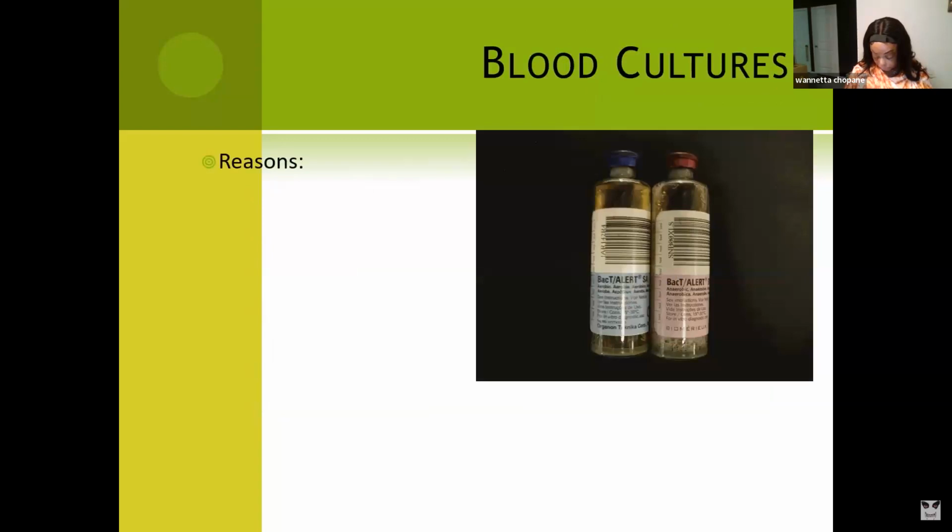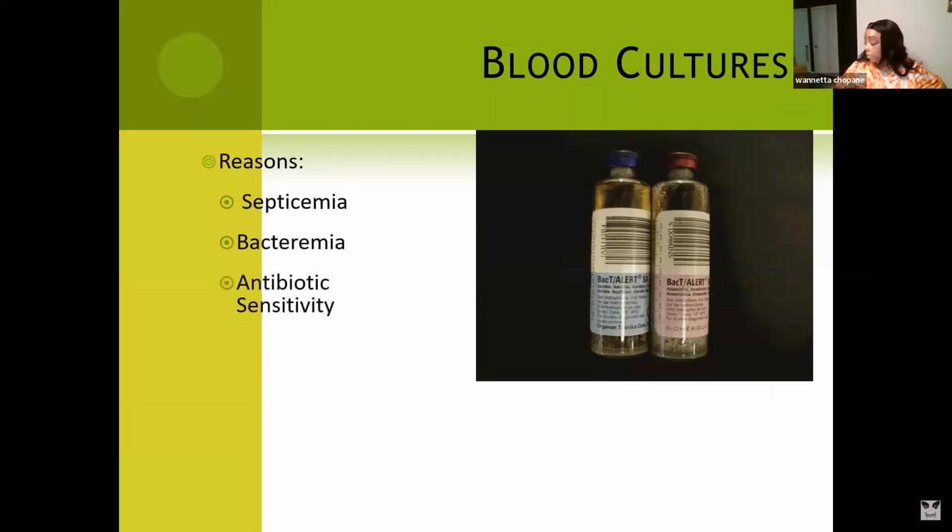Now let's talk about blood cultures and why a doctor will order blood cultures. One reason is to check for septicemia. If a patient comes in with the symptoms of fever, chills, or tachycardia, the doctor will order blood cultures to determine if there is a bacterial infection that's circulating through the blood throughout the body. Now, if there's no symptoms, but the doctor suspects that there might be a bacterial infection, the doctor will check for bacteremia. And again, we might also check for an antibiotic sensitivity on the patients.